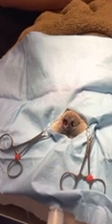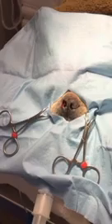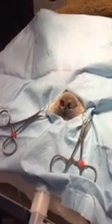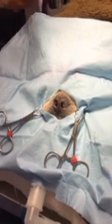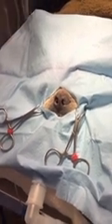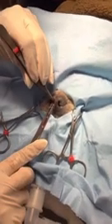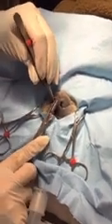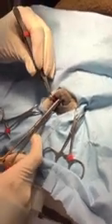We're going to use some absorbable suture — Lauren, can you get some 3PDS please — so that it will dissolve. We just do a little simple interrupted suture pattern. I usually start on the lower side in the deep part and get that tied up pretty good.